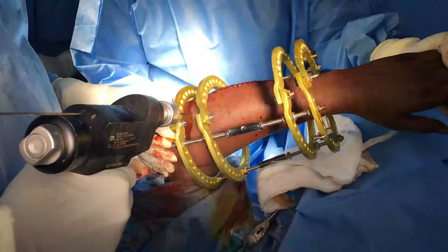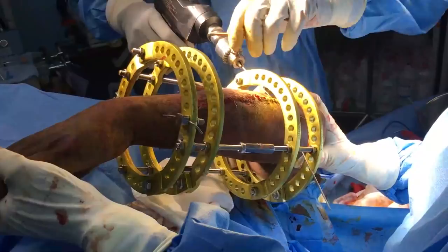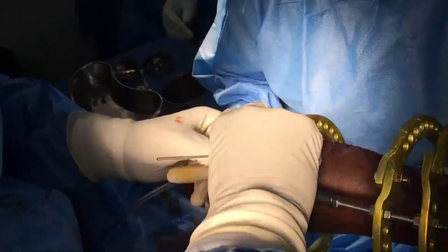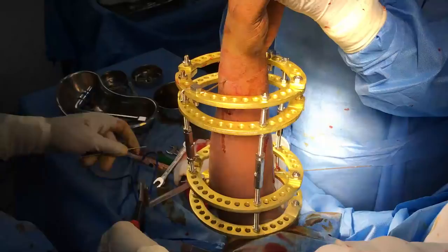The second wire is on the most proximal ring. Once again, it is an ulnar wire passing entirely through the body of the ulna, which can be felt as a triangle at this area. One end of the wire is tightened while the opposite end is tensioned, and the edges are trimmed.